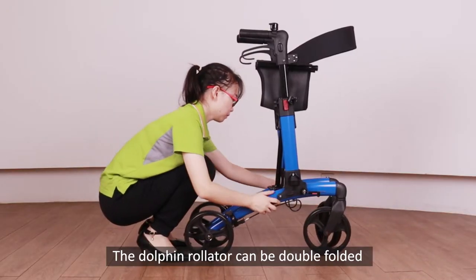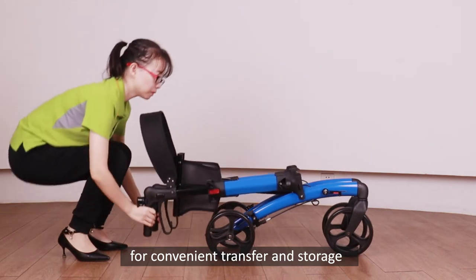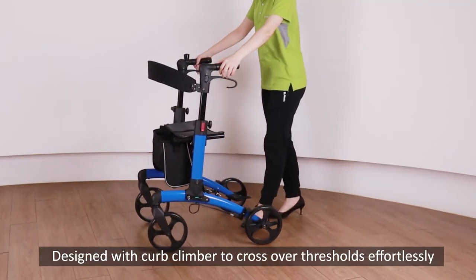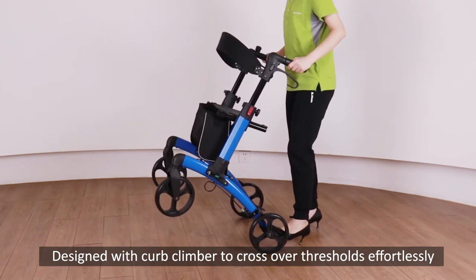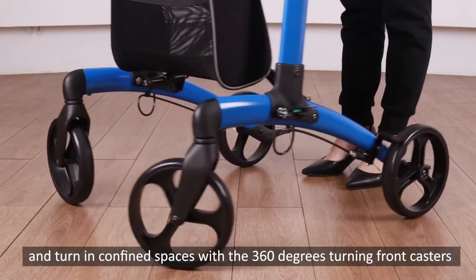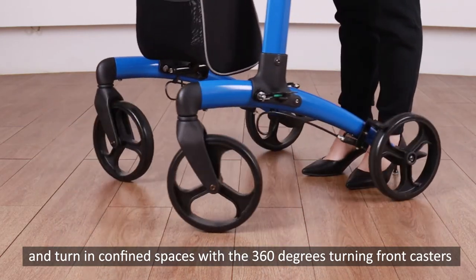The Dolphin Rollator can be double-folded for convenient transfer and storage. Designed with a curb climber to cross over thresholds effortlessly, and turn in confined spaces with 360-degree turning front casters.